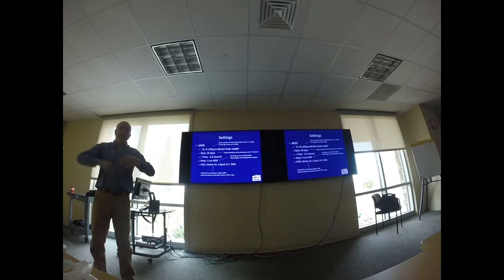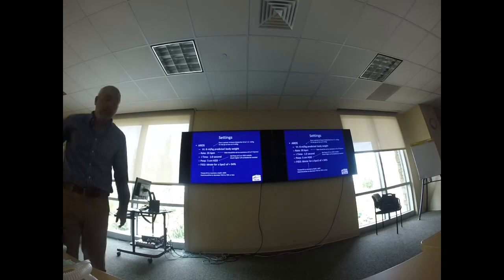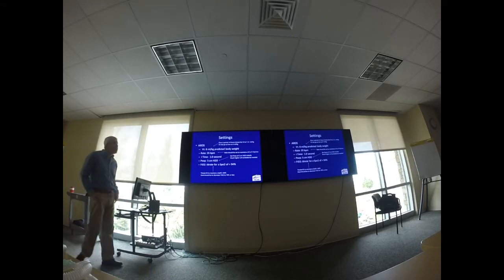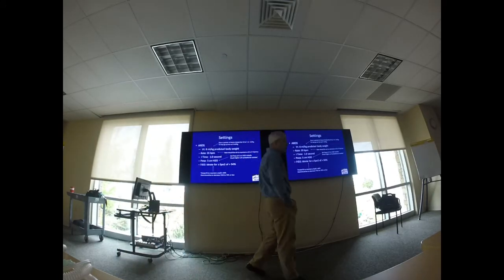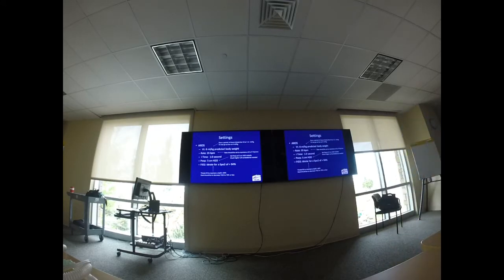Because just because I'm 120 kilograms doesn't mean my lungs are any longer, right? They're still the same lungs that they would be if I were 60 kilograms. So I'm going to use an 8 ml per kilo predicted body weight. But it says over a period of less than 4 hours, I'm going to titrate the tidal volume to 6, it could be as low as 4 mLs per kilogram for that patient, right?